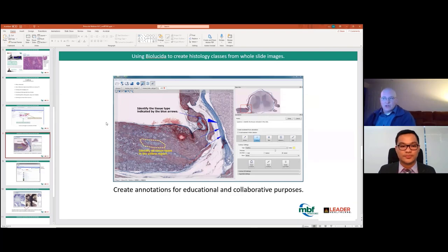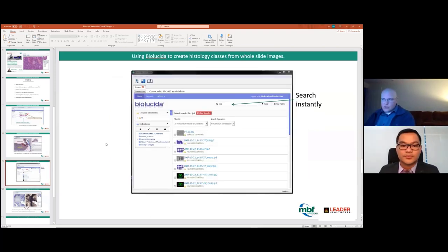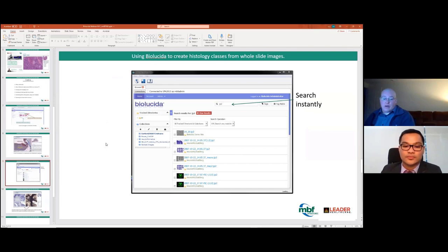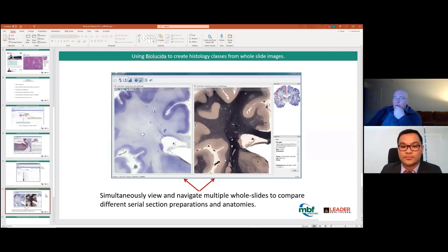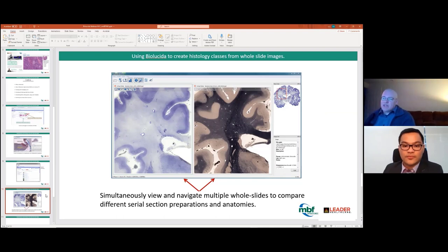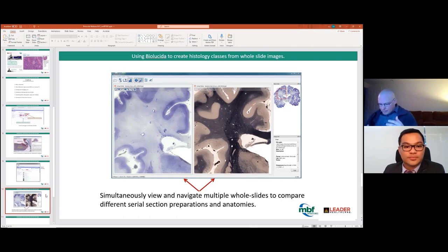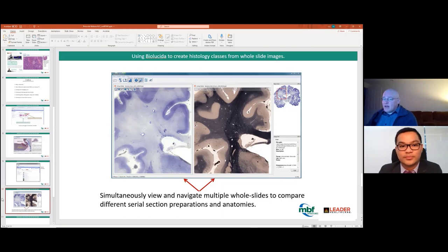For annotations, we model things off PowerPoint — if you can draw in PowerPoint, you can make annotations in BioLucida. Students will be able to mine the slides they have permission to. For comparative anatomy, you can open multiple slides and lock them — for example, a primate coronal brain section where the left side is a Nissl stain and the right side is a myelin stain — and zoom in at the same magnification and same brain area. There are a lot of viewing capabilities within BioLucida.